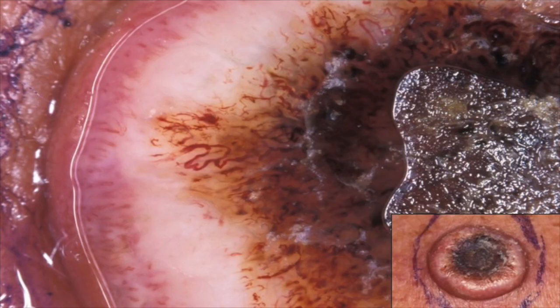Now, I'll give you an example. This is clearly a keratoacanthoma. There's no question about this. But it's just to highlight that the hairpin vessels here, here is your perfect hairpin vessel, right? But most of the time, your hairpins are not going to be so perfect.